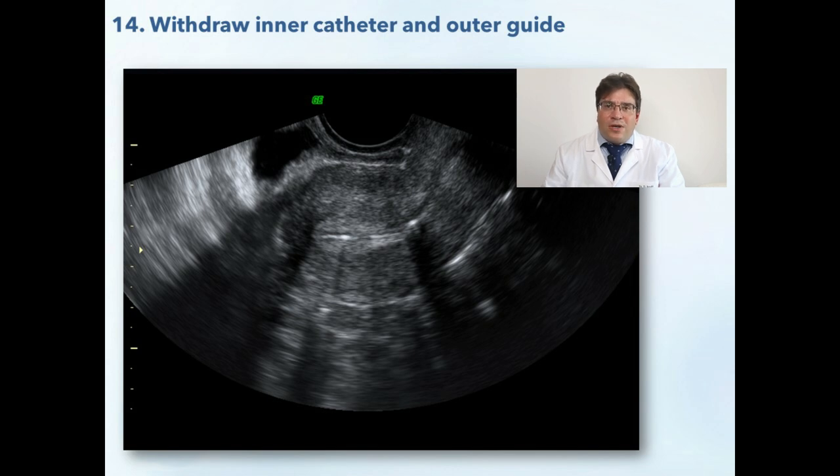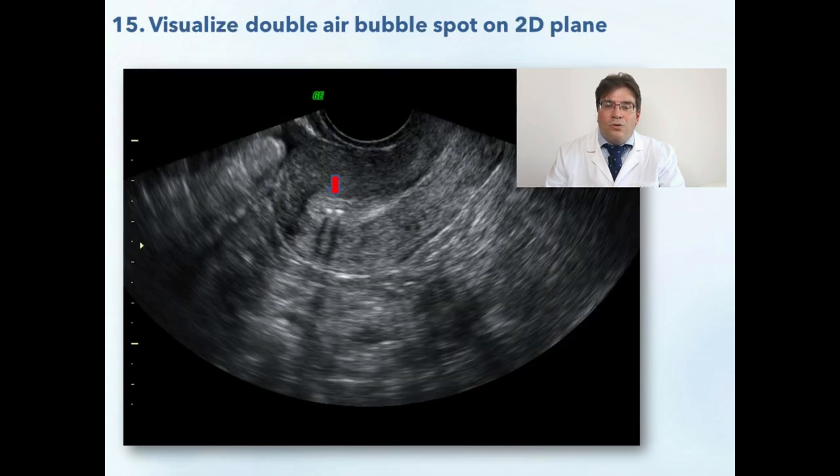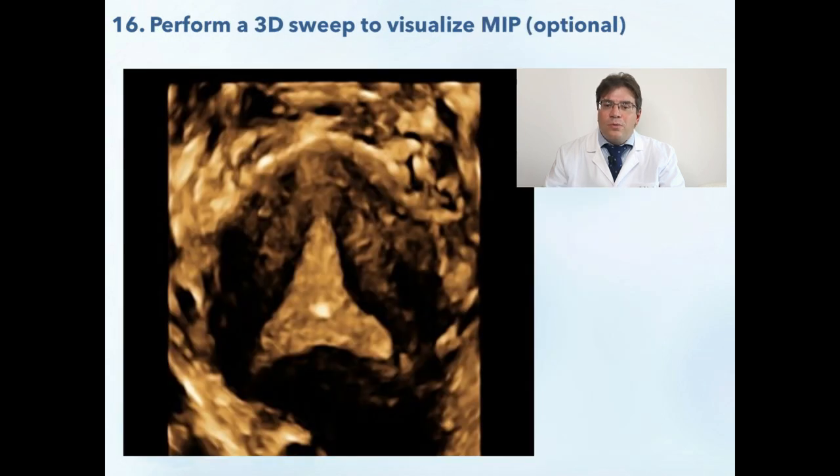Because under direct observation embryo retention is extremely rare, there is no need to keep the outer guide in place. Now you could observe the final result of your embryo transfer and make some photos for your medical file and the patient. Because of the thin diameter of the inner catheter, the injected volume is very low, so the air marker bubbles tend to stay at the injected position and not wander around. If you have the option, you could also perform a 3D sweep to visualize the marker air bubbles on a 3D frontal plane.